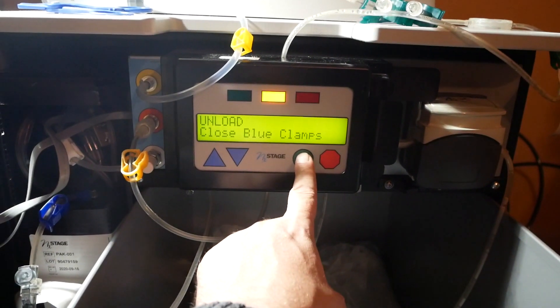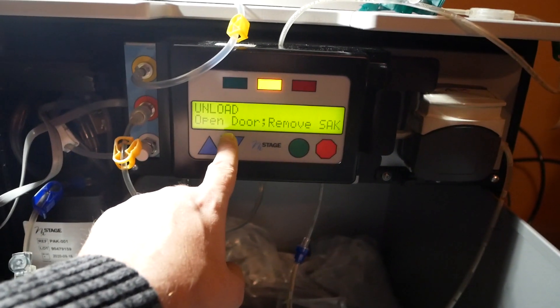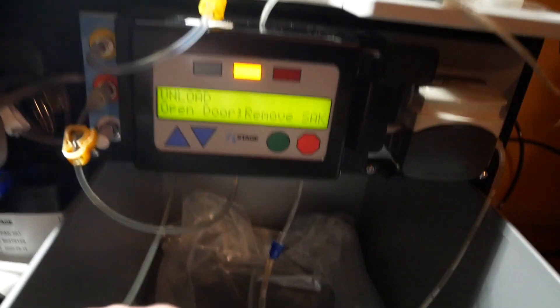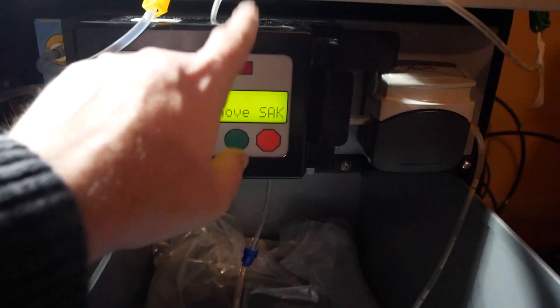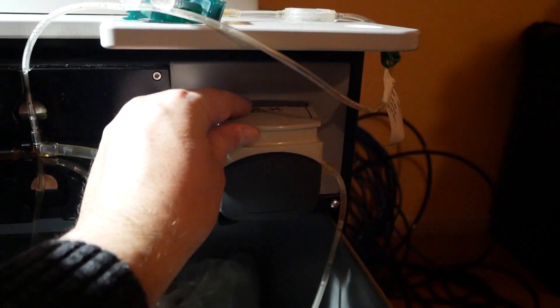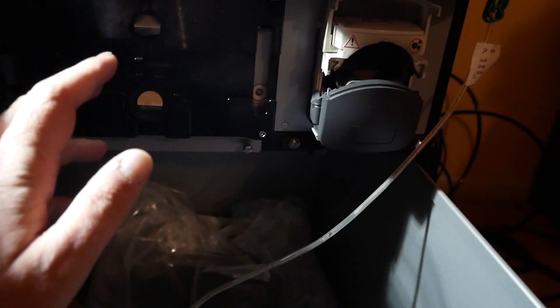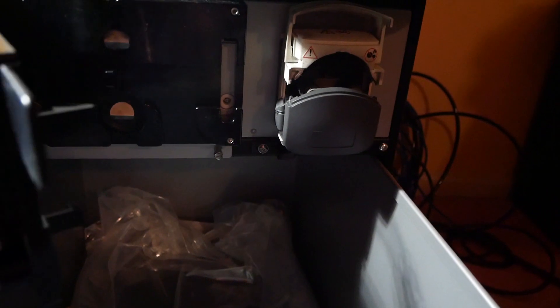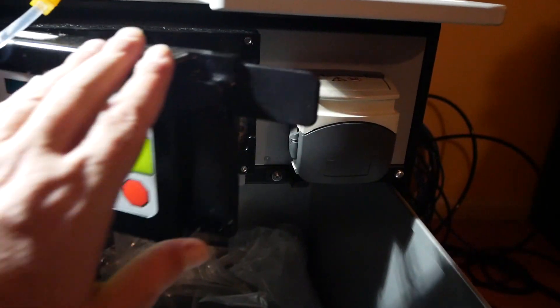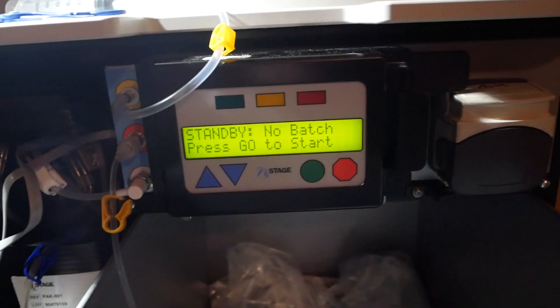Now that they're all clamped I hit green and it says 'unload, open door, remove sack.' The door it's referring to is this thing, so you open this and this one like so. You can just pull it and it falls right out into the bucket. Take your chicken foot piece that goes in there too, then close both doors back.